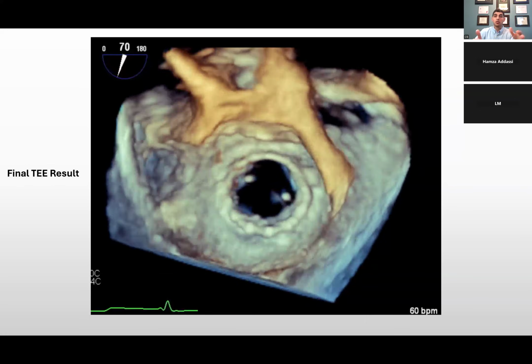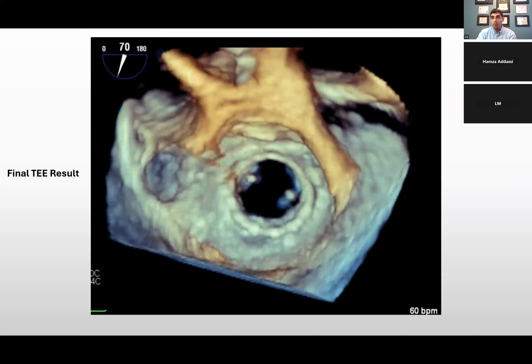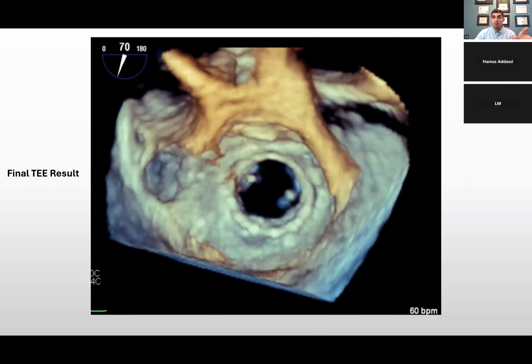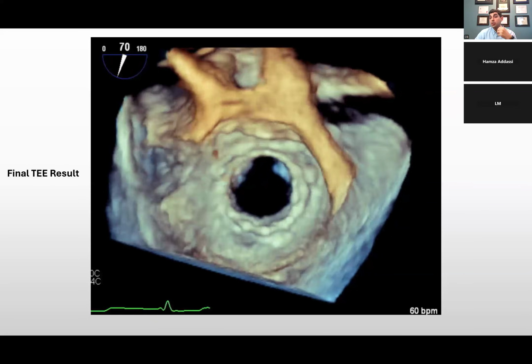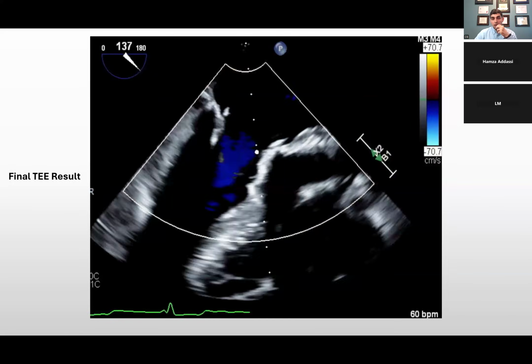And then the company said you can't do this because if you put a valve, it's going to block the blood flow. So you were faced with a problem, and you think outside the box. And that's what structural is. It's not about memorizing steps. It's about concepts. You understand concepts to be able to do procedures that have not been done before. And so this patient went home and is doing well.